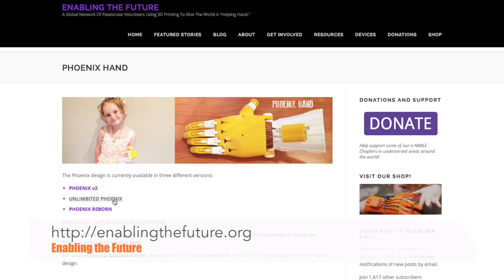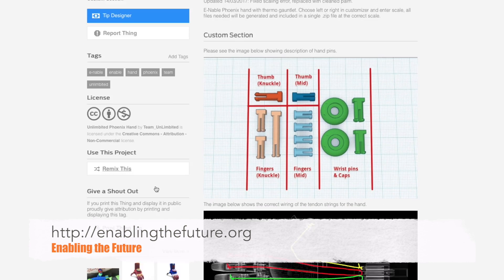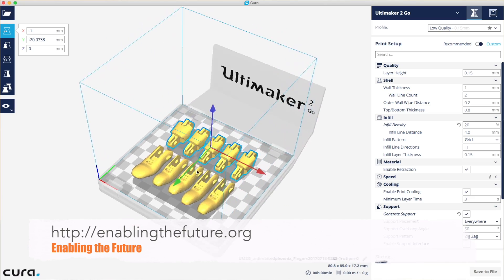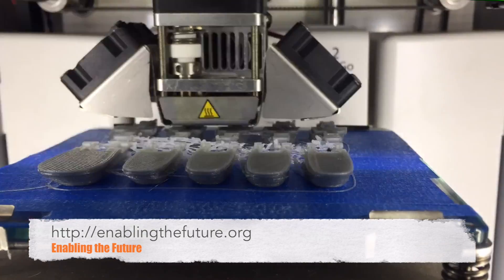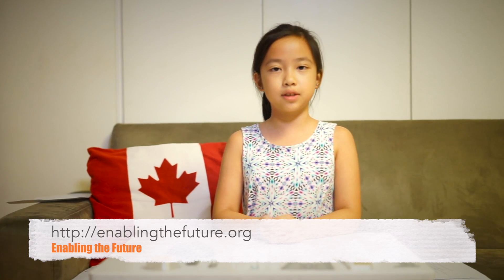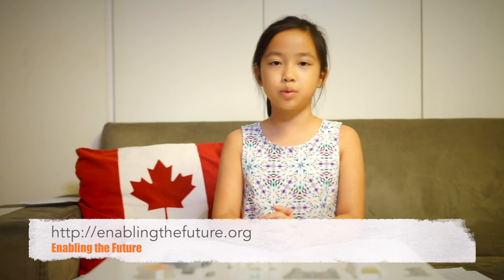I started by going to the EnablingtheFuture.org site to choose the hand that I wanted to build. After that, it was a simple case of loading up the files into the 3D printing slicer software to create the print files. With all the parts printed, and a few extra parts, we can put it together starting with the fingers.